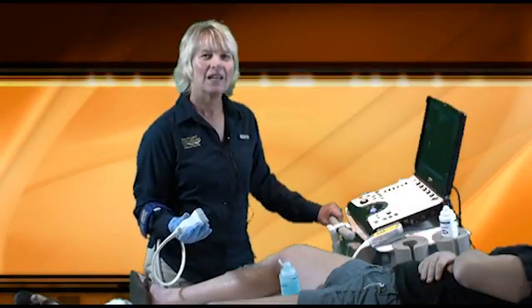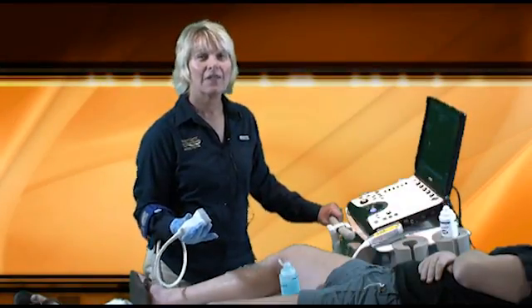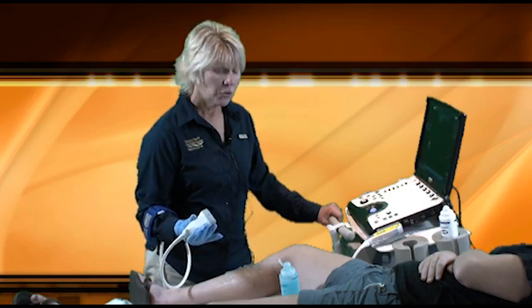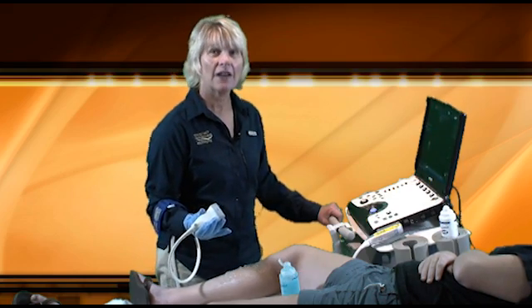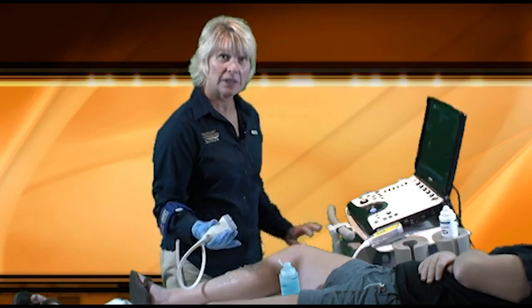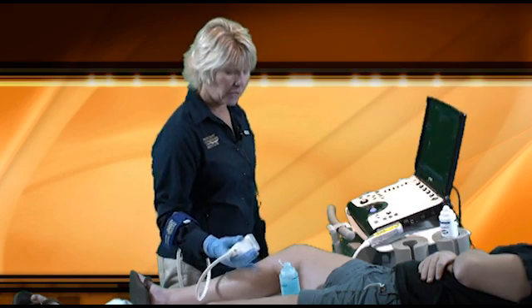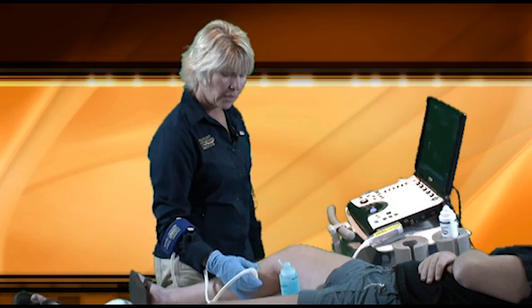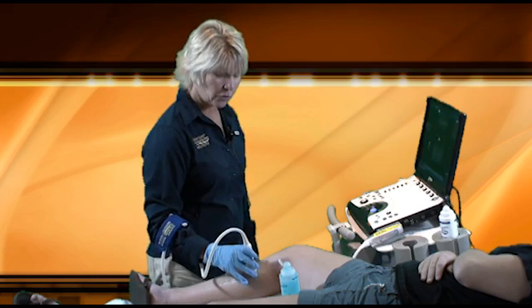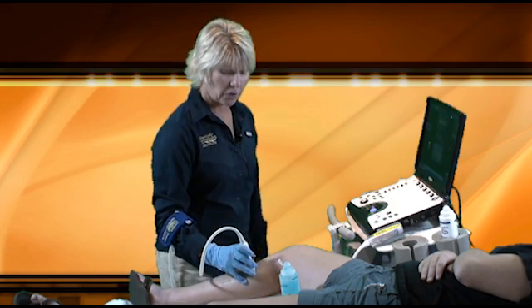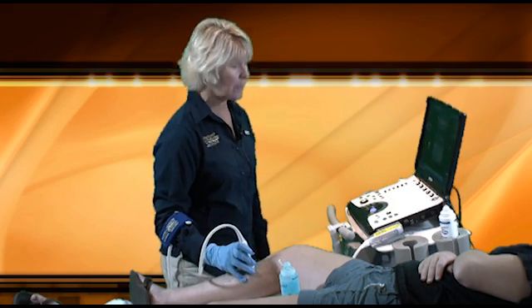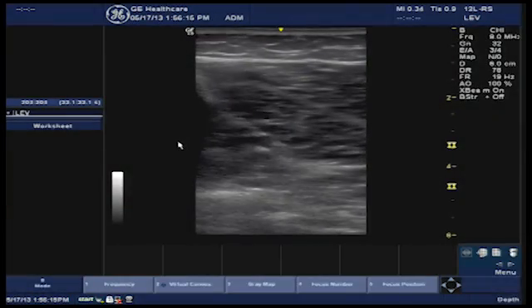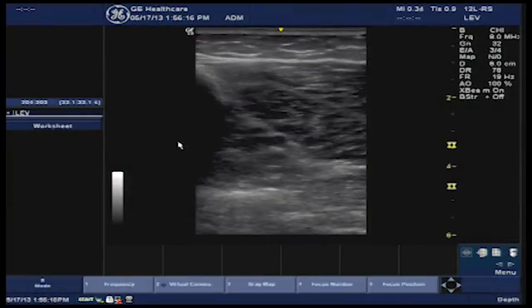Today's hot tip of the day is how to easily find the calf veins. Once you have completely evaluated the popliteal vein and the gastrocnemius and soleal vessels, you want to slide your transducer along the medial aspect of the leg and identify your anatomical landmarks.